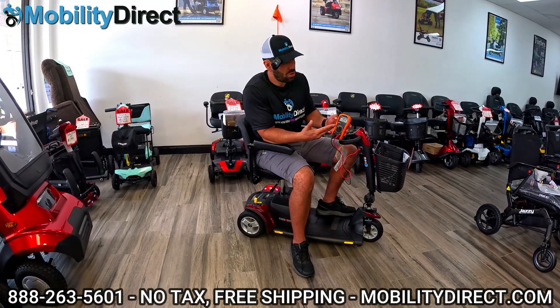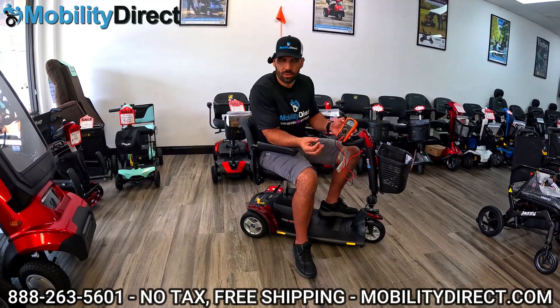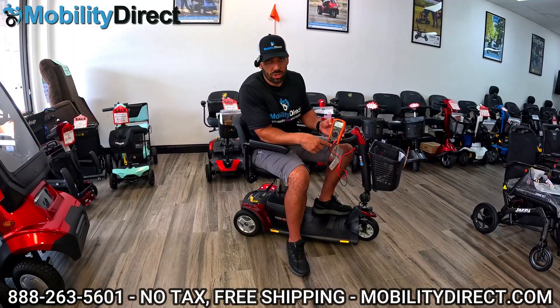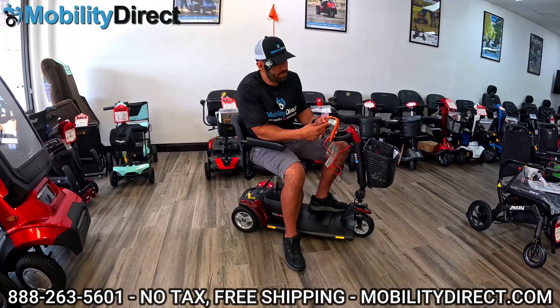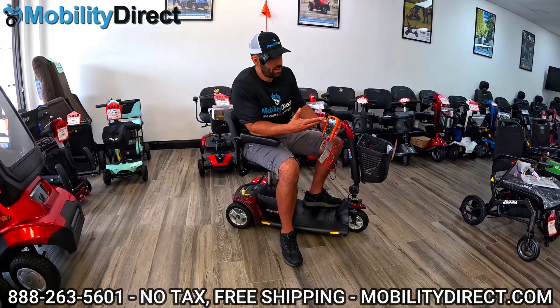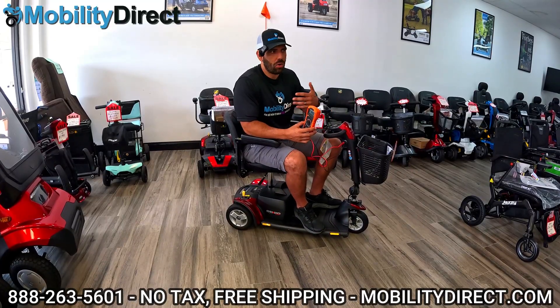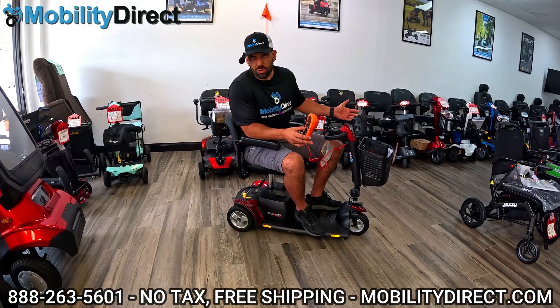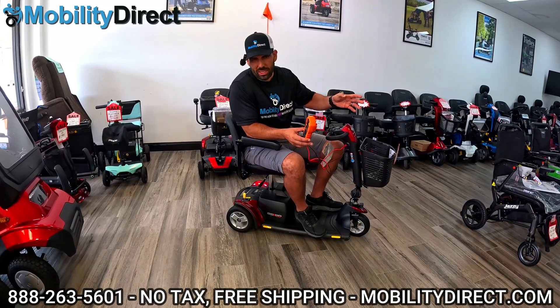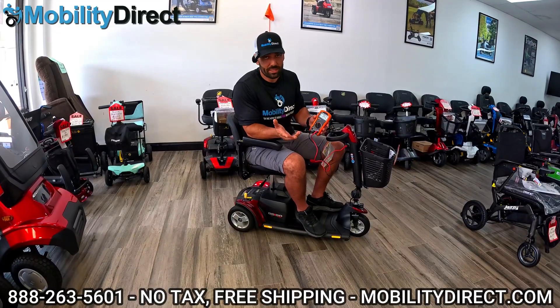99% of scooters work on a 24-volt system, which means they need a minimum of 24 volts to perform optimally. As you can see, these batteries are charged up adequately at 25.4 volts. What you want to do next is test the voltage readout while moving and while sitting on the scooter — what I call a load test. It's a very crude way to do it, but you can do a very professional load test with a machine. I've been a technician for over 11 years and this method has never failed me.